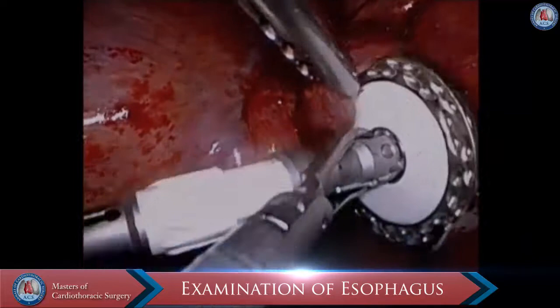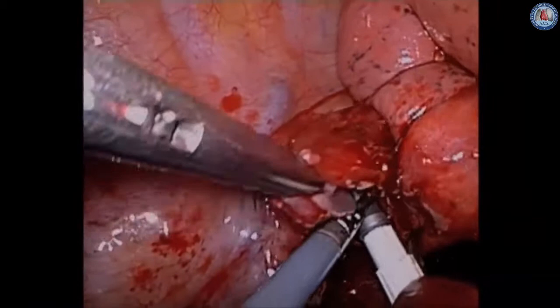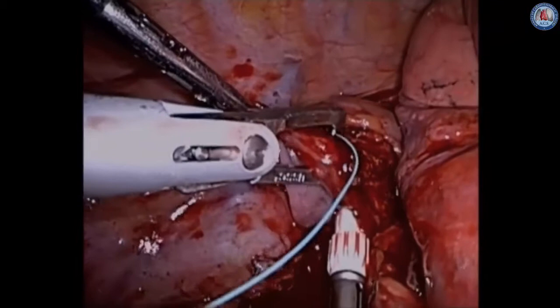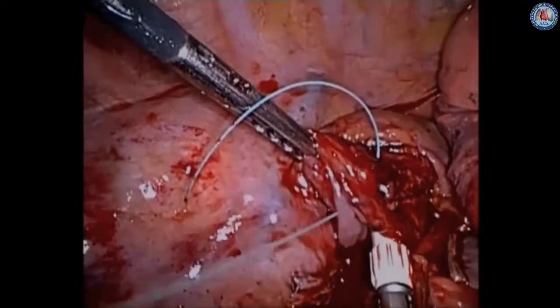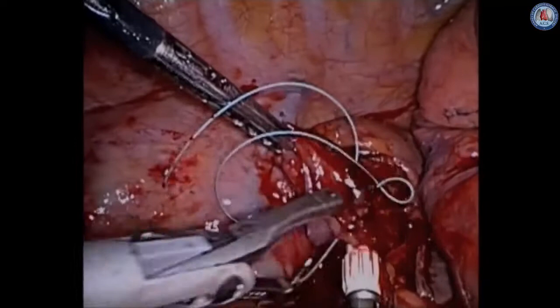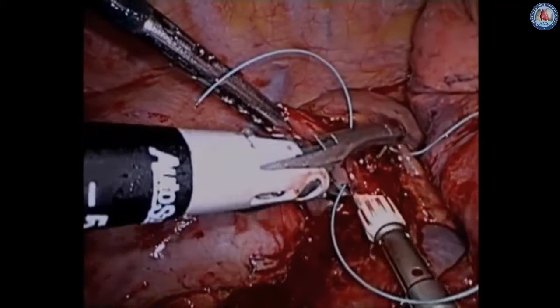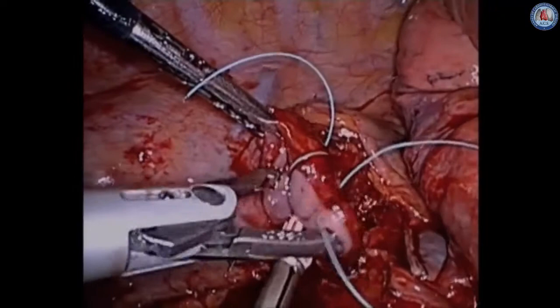If the opening is adequate, we tend to use an EEA stapler for the anastomosis. 25 and 28 millimeter EEAs are the most common sizes utilized. The EEA is placed into the opening and two purse-string sutures are placed to snugly close the esophagus around the anvil. The initial stitch is a baseball-type stitch to make sure that you get the mucosa snugly around the anvil. There are different techniques for this portion — some surgeons opt to place these before cutting the esophagus; our preference is to do this after, as we can see the mucosa better.